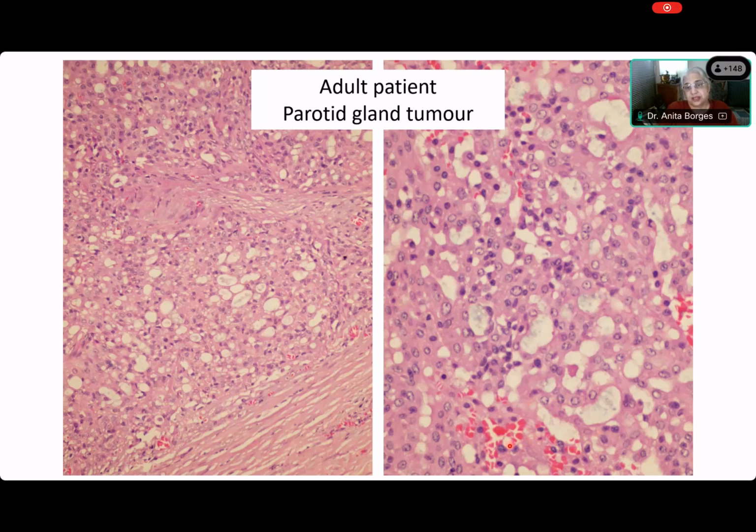Now you can see that these are cells, and they seem to have some secretions, and these spaces are irregular, as if the cells are secreting something and the spaces are being formed. That's the appearance that one is getting, because there are no well-formed tubules or well-formed glands. Do you agree with me, Madhu? Yes, ma'am. There aren't. It's just spaces that seem to be the result of, like you saw in the adenoid cystic thing, where there is secretion, in that case into the stroma, and there are those spaces that are being formed.